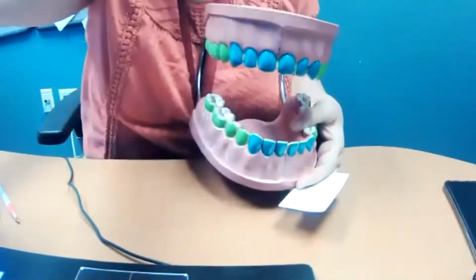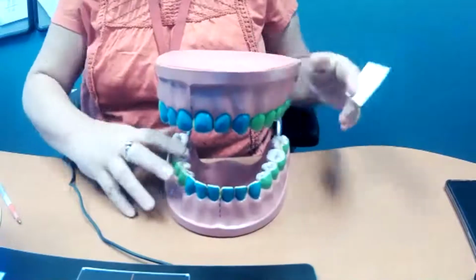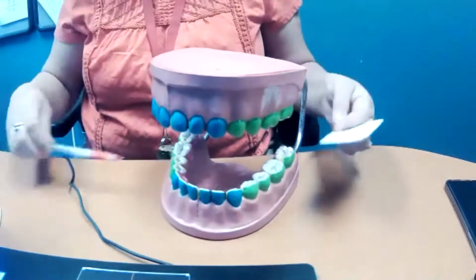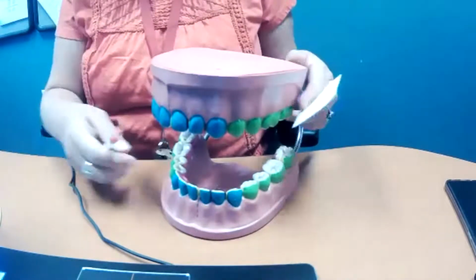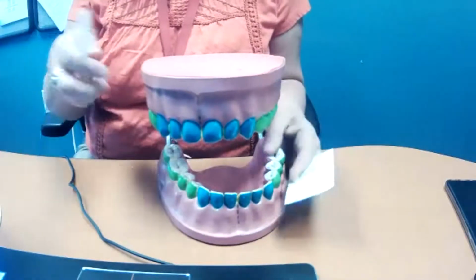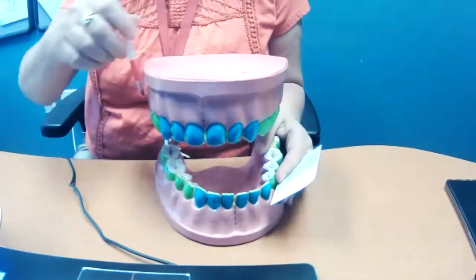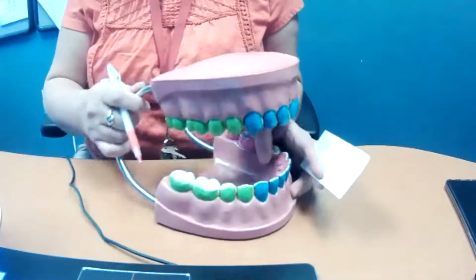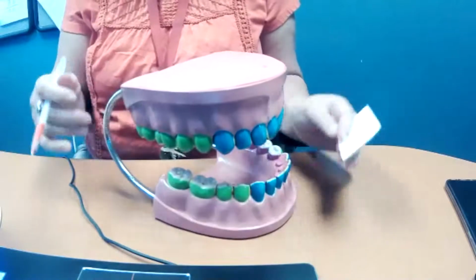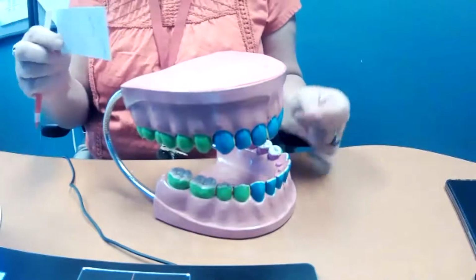I've got this big old mouth that's kind of heavy. All right. So we just kind of went over horizontal positioning, goes from side to side. Now, vertical positioning would be my PID coming up and down this way, right? Moving the tube head this way. So some things can happen there that are also wrong. And I just have this little card here, it's being my film right now.